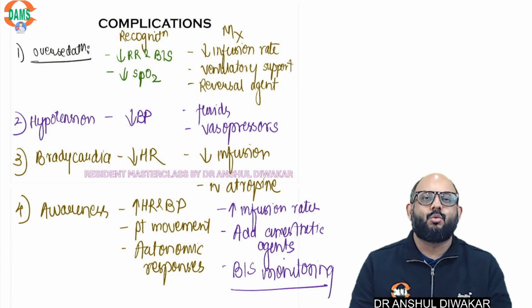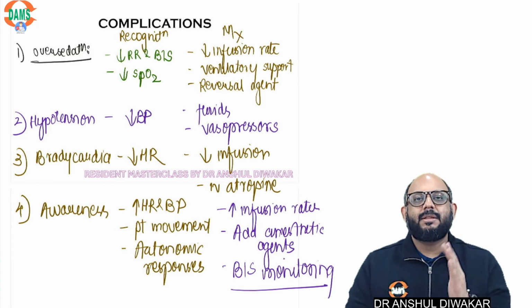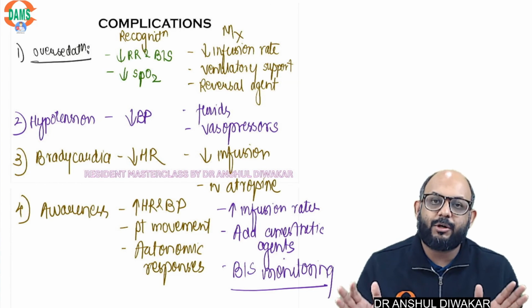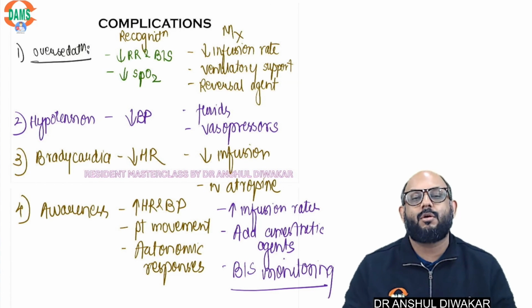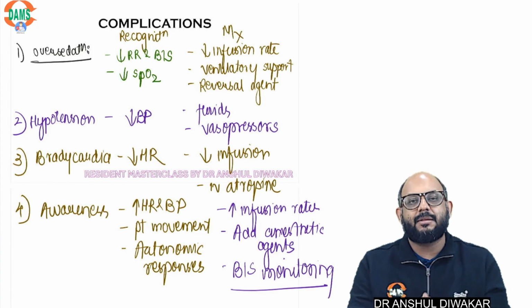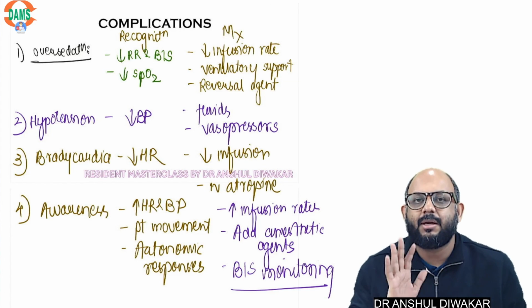Also, one thing that you need to understand is when you are using two drugs, you can never combine these two drugs in one infusion. So you will have multiple pumps which will then integrate and give the drug. So there is going to be an integrated model where you put in that there is another infusion going on, say propofol. You need to know that when you use propofol with remifentanil, the concentration of propofol required would be lesser. So what you put as a target concentration would be lesser.